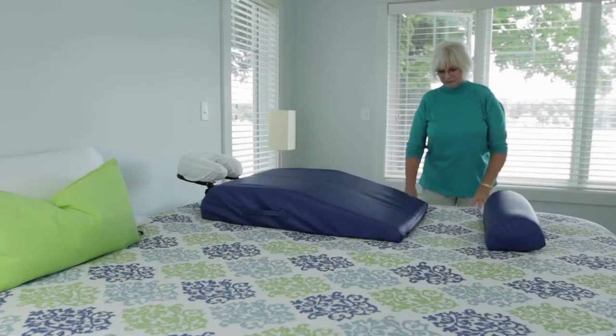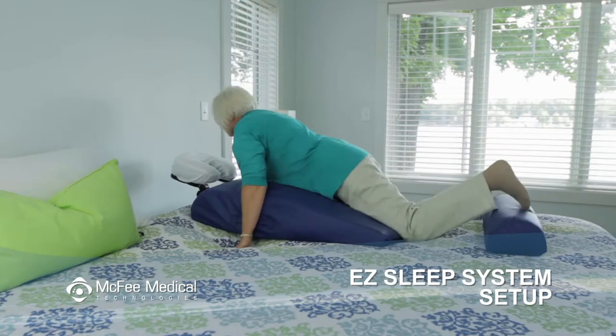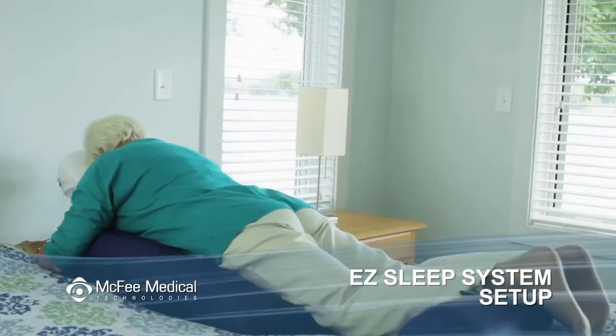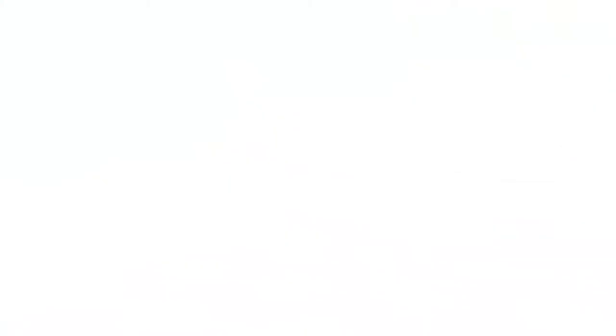Now lie on top of the torso cushion with your shoulders positioned near the thicker edge of the cushion. Lift the U-bar to a comfortable position and tighten the knobs once the appropriate height has been achieved. Your eyes and nose should be pointed down toward the mattress.